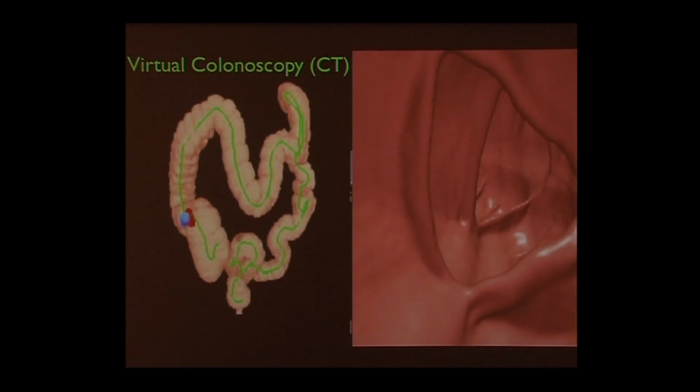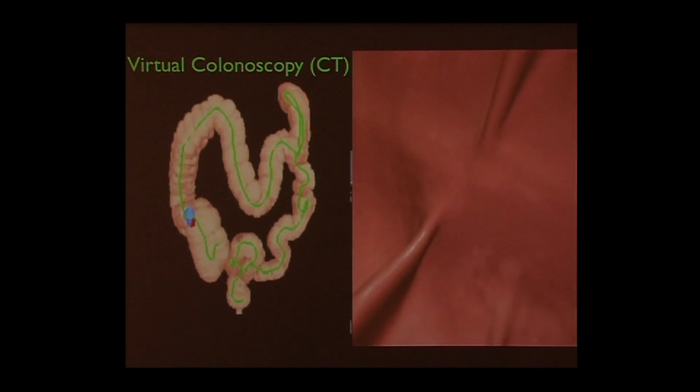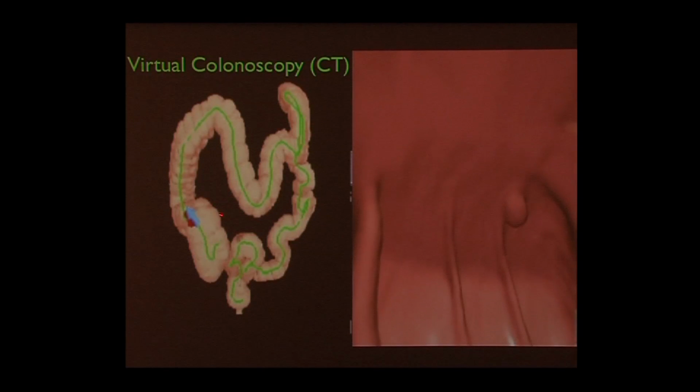And here's just a short little clip of a travel through the colon and then back to a 6 millimeter polyp. That's only 6 millimeters. And we can tell exactly where it is in this model of the colon. This was created from the patient. So this is the patient's actual recreation of the path that we go through. And we know exactly where it is. We can tell the gastroenterologist exactly where that polyp or mass or whatever it is we found is.